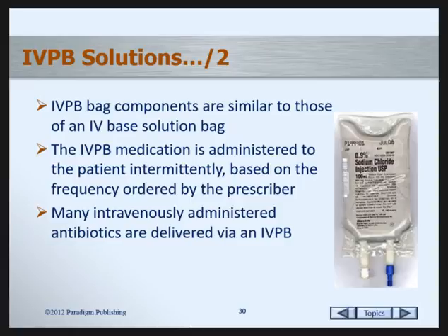The components of a piggyback are similar to those of the base solution bag. You've got the hang loop, you've got your injection port, and you've got your tubing port. Also on an IV bag, you're going to see the product, what's contained in the bag. You're going to generally have a lot number. You're going to have its expiration date, and there's also often a calibration marking on the side.